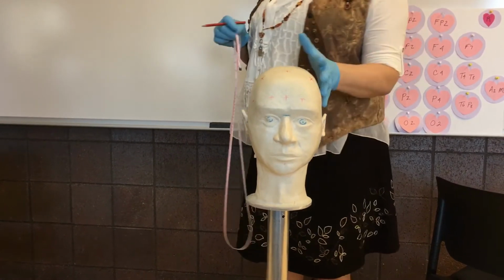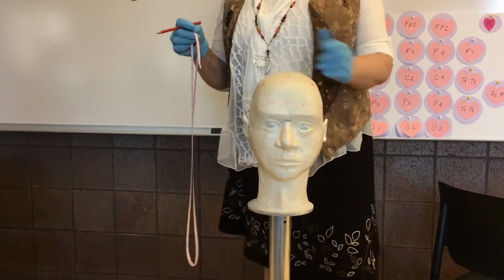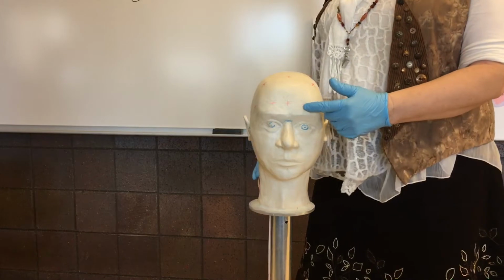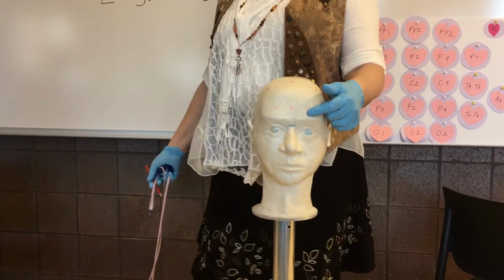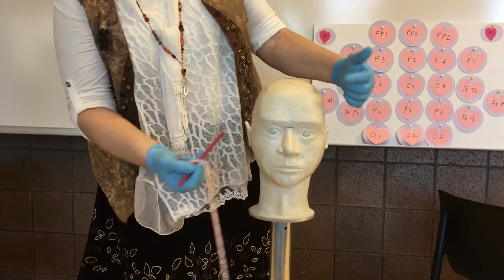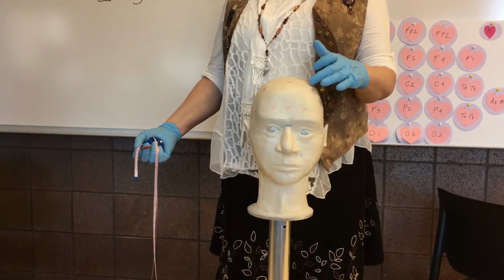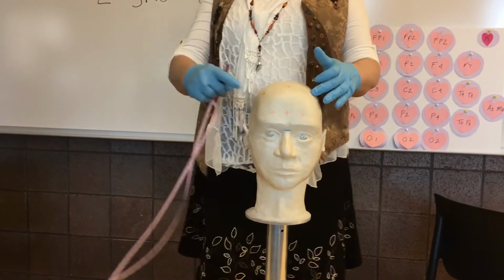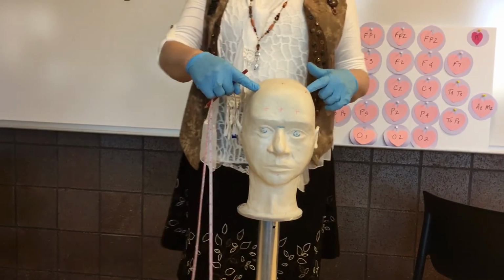So now when I say I want to find out if these electrodes are symmetrical, what's this electrode here on the left side of the head? FP1. The homologous electrode on the right side of the head is what? FP2. What's this electrode here? F3. And the homologous electrode is what? F4.